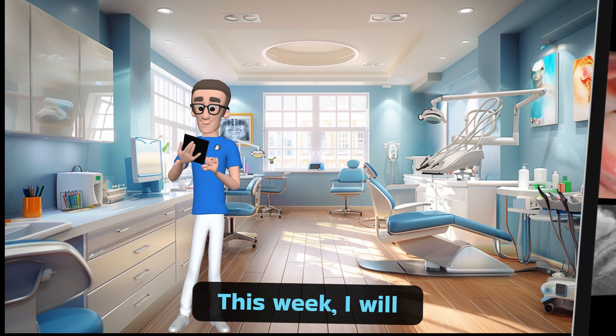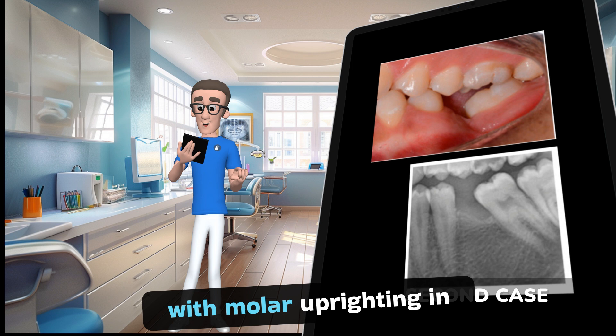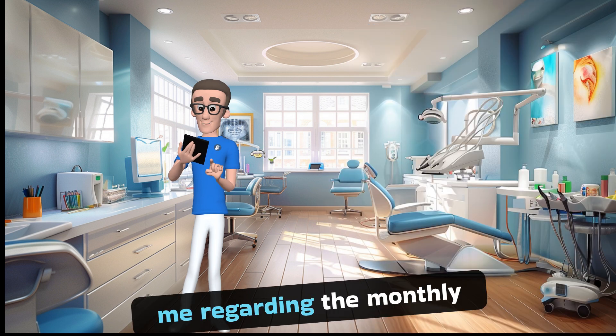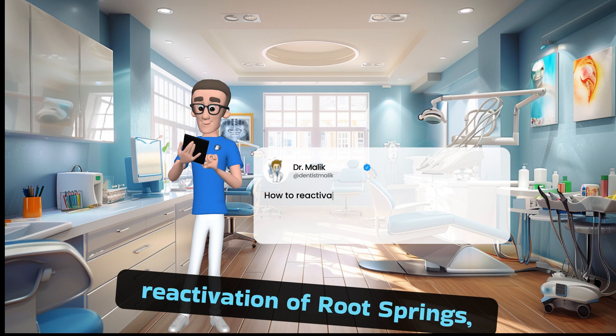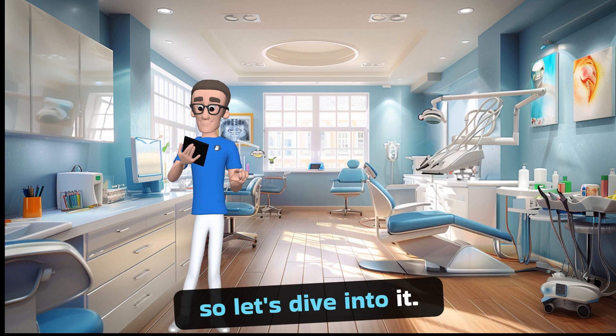This week, I will be assisting Dr. Malik, who's facing challenges with molar uprighting in several cases. He reached out to me regarding the monthly reactivation of root springs — a topic worth exploring further. So let's dive into it!